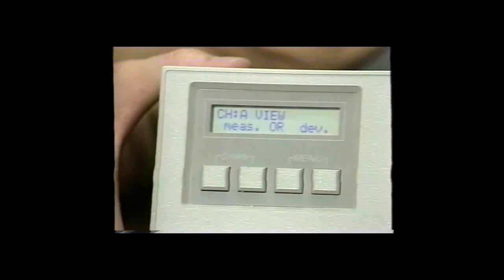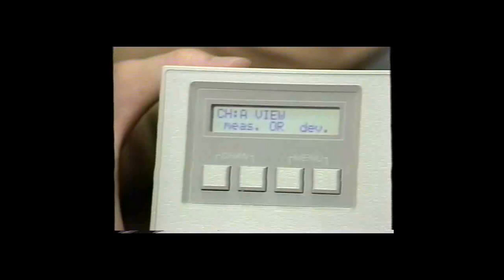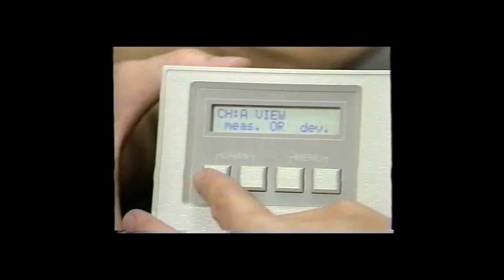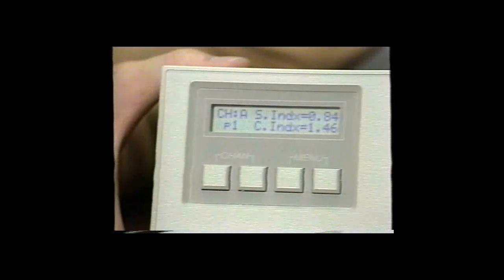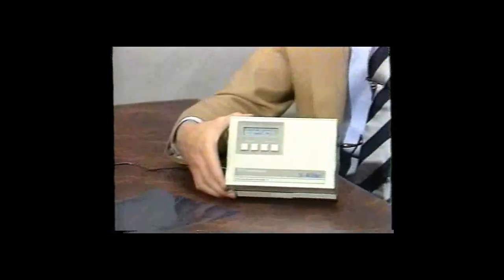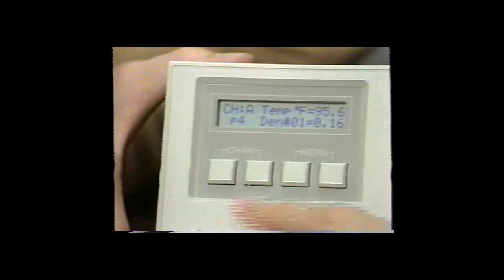Next, the densitometer gives you the option of how you would like to view the strip data. You can either view the measured values off the strip as calculated, or view the deviation from your previously entered reference values. To view the actual measurements, push the key directly under measure. Page 1 displays speed and contrast index. Page 2 displays base plus fog and D-max. Page 3 displays average gradient and gamma of the film. Page 4 shows the processor temperature as entered earlier, as well as the densities of the individual 21 steps.